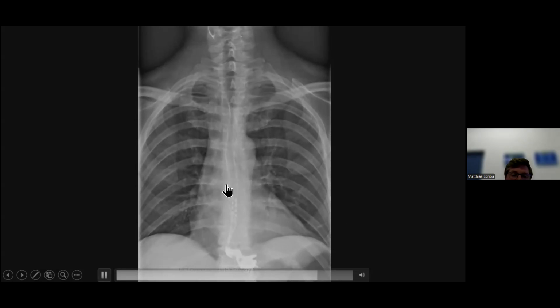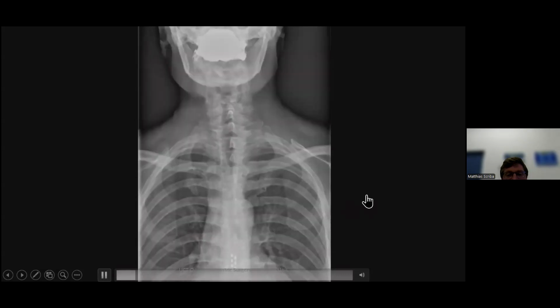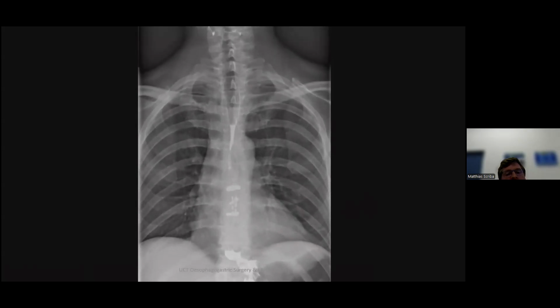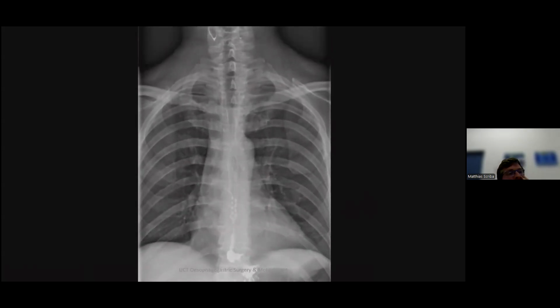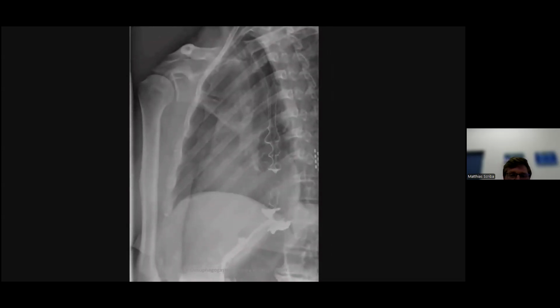Okay, so I'm going to show you the lateral now. This is the nerve stimulator, which is a bit confusing, but let me run the swallow again. And what you can see distally is that the esophagus is doing something we call beading. You can call it a corkscrew if it looks like it's twisting, but this is classic beading, and it's more evident on the lateral here.